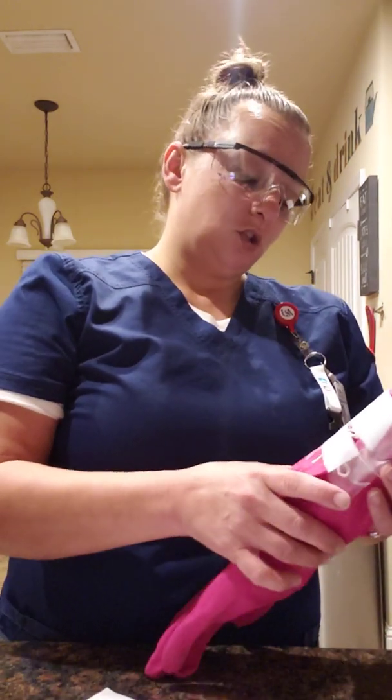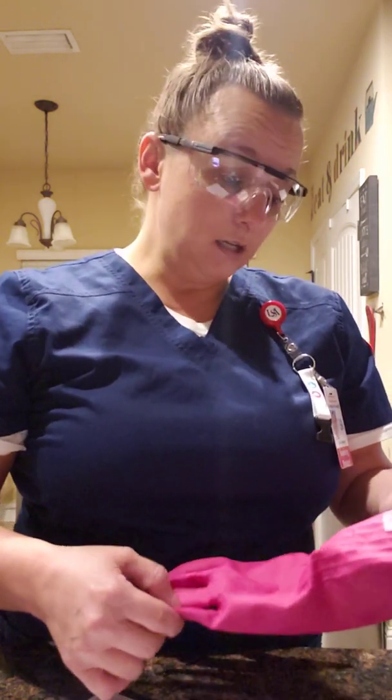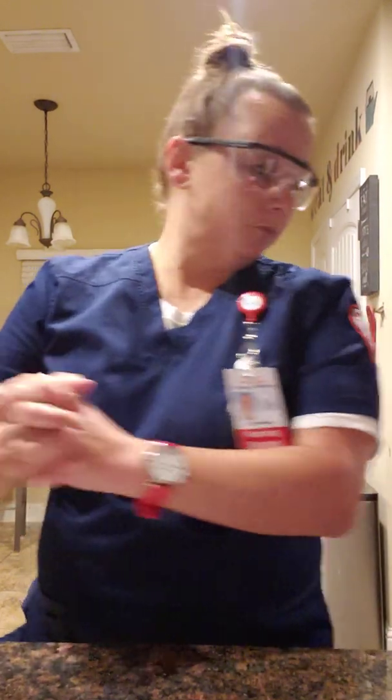Mr. Jones, I see that you are allergic to penicillin. Do you have any other allergies? No other allergies. All right, good deal. So, Mr. Jones, I'm here to give you your morphine for pain. How are you feeling? I would perform hand hygiene and don my gloves.